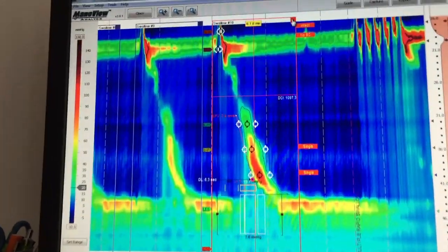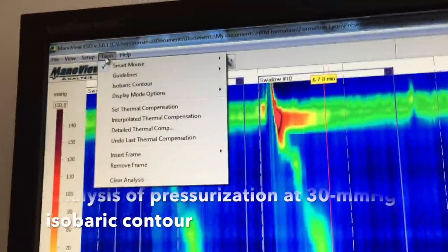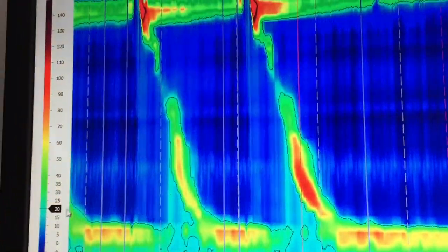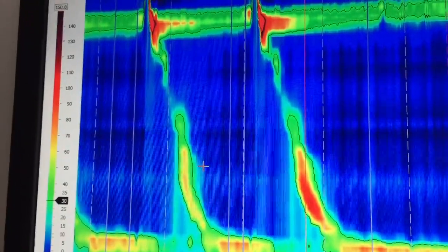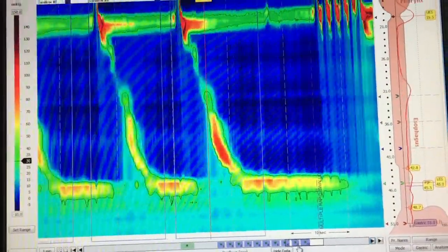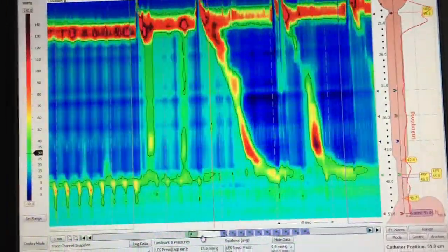Once I have reviewed all the swallows, I have to look for abnormal pressurization. To do so, I go into the tools and select the isobaric contour. Then with my cursor I move to 30 mmHg, because we are looking at pressurization at 30 mmHg. I will go through all 10 swallows. In this case, there is no abnormal pressurization.